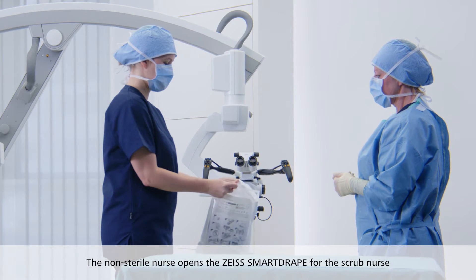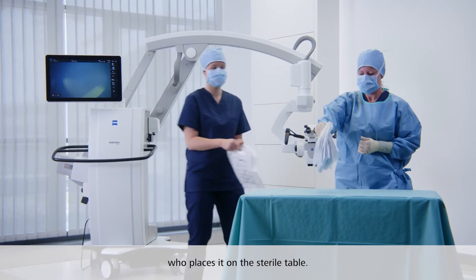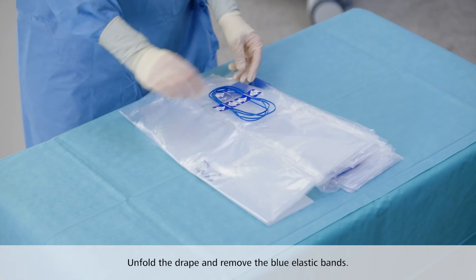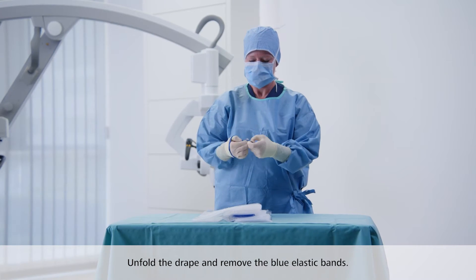The non-sterile nurse opens the Zeiss SmartDrape pouch for the scrub nurse, who lifts it up and places it on the sterile table. Unfold the drape and remove the blue elastic bands. The bands can be put on your wrist to be used later should you need them.